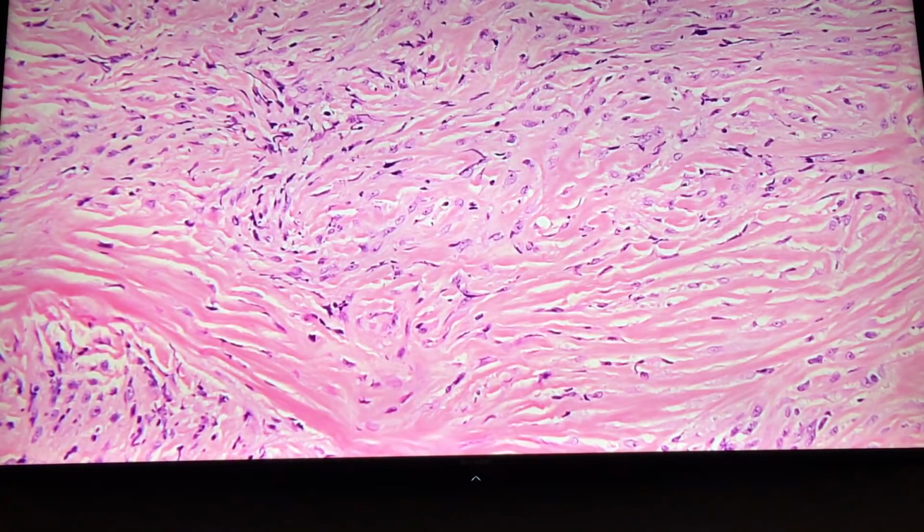So this is the kind of case that is very likely to be misdiagnosed, or even the best pathologists sometimes can't diagnose this because it looks so much like benign tissue. So what are the clues that it's malignant? It's infiltrating into the fat. There is a malignant epithelial component next to it. And then there are other subtle things like areas of hypercellularity, areas of necrosis in between it, a storiform pattern.